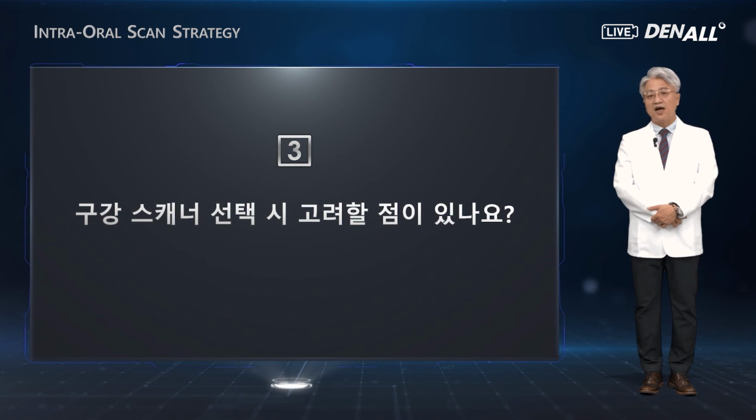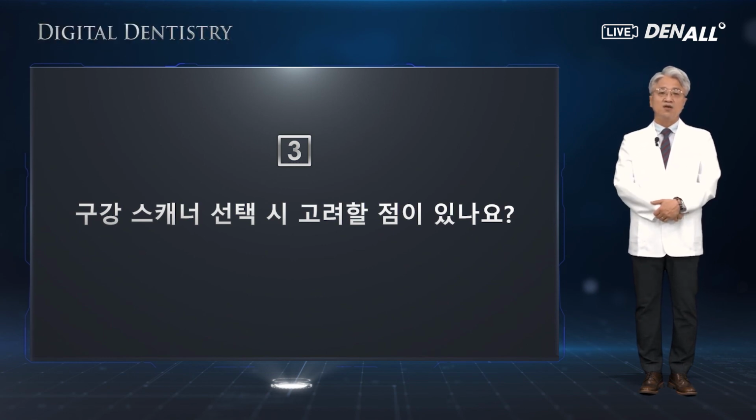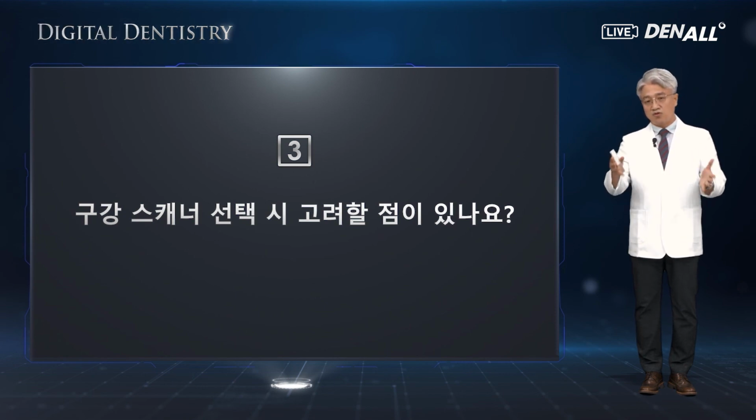If the scanner runs very slowly or it takes a lot of time for post-processing, if the speed is slow, it will be very hard for the dentist as well as the patient. So you'd better choose a scanner with better performance.